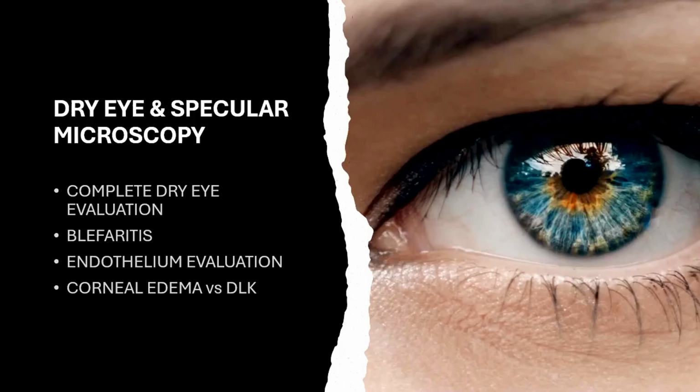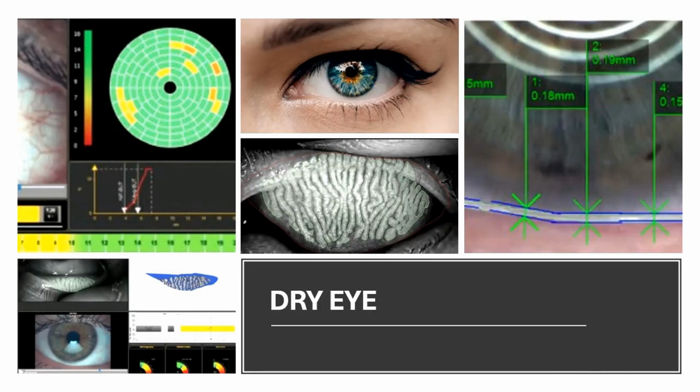We have added two types of analyses to the protocol, one for dry eye and one for the corneal endothelium. For those patients in whom there is a suspicion of primary dry eye or dry eye secondary to contact lens use, allergies, blepharitis, or systemic diseases, and the performance of a specular microscopy in cases where laser sessions may cause corneal edema in order to make an accurate differential diagnosis. The dry eye study is comprehensive and quantitative.